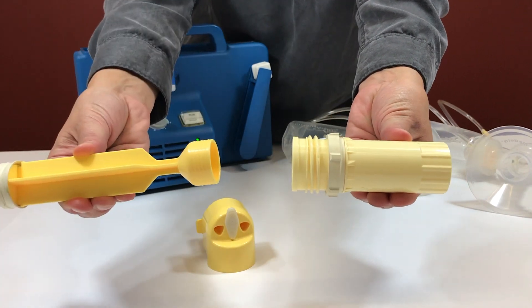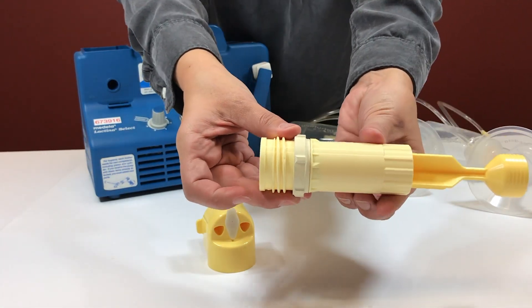Slide the piston in the cylinder and screw it on the yellow connector. Make sure the tabs are secure in the slot.